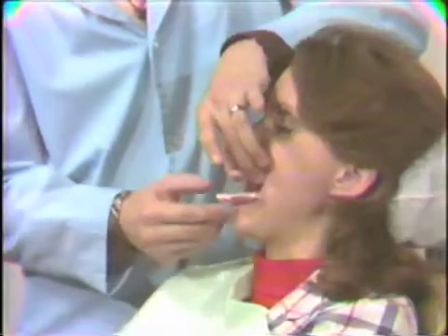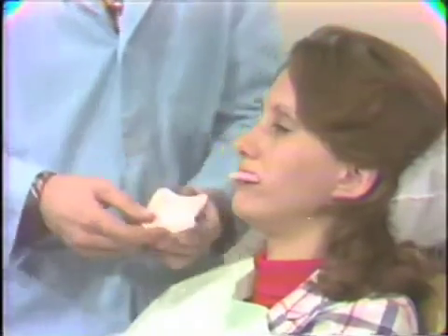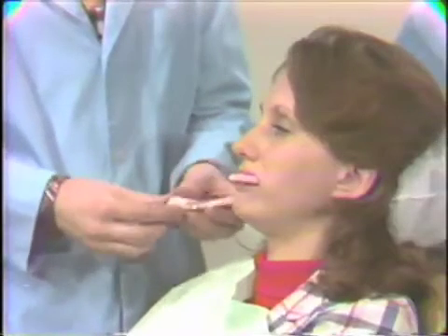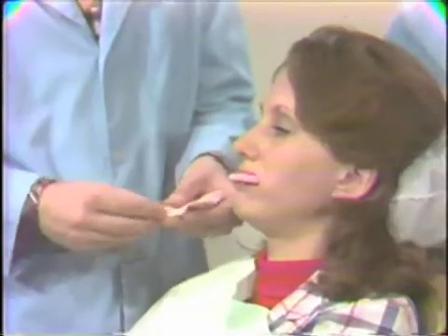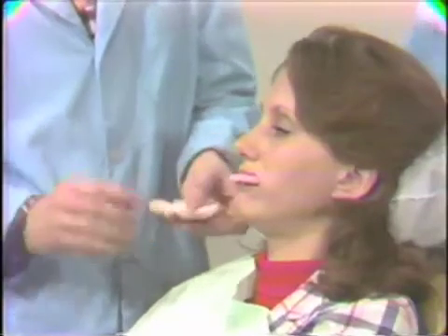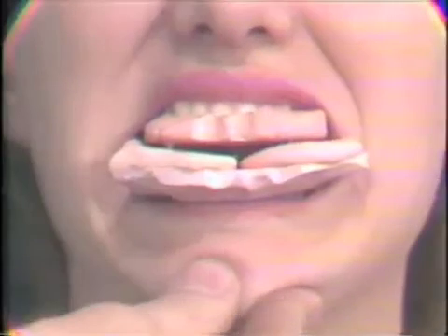We do this by removing the lower clutch. Okay, just bite together and hold that. And we make 4 little puddles of acrylic that correspond to our cutter studs of the upper clutch. I think that should be plenty. Okay, now we reinsert this in the mouth. Okay, bite together. Make sure that our studs are in contact with the acrylic.